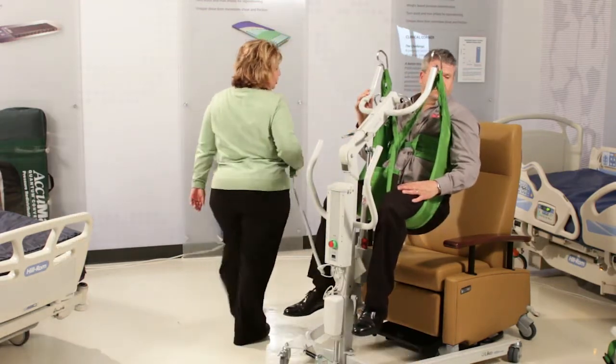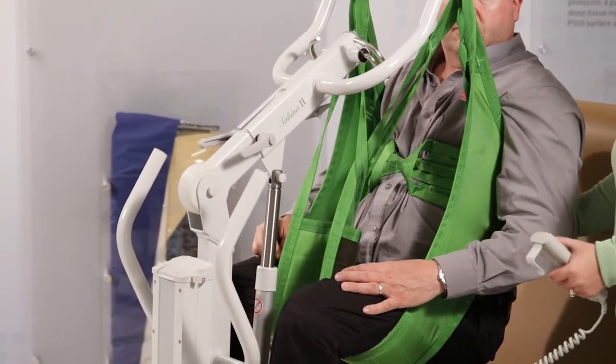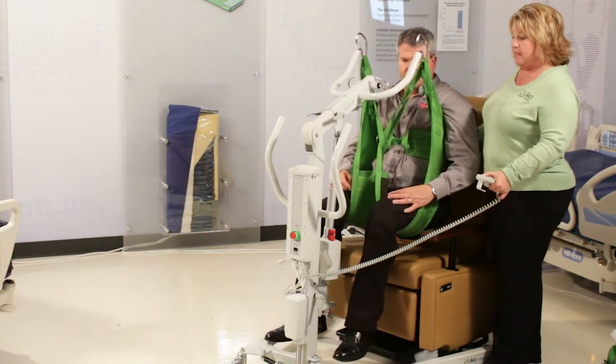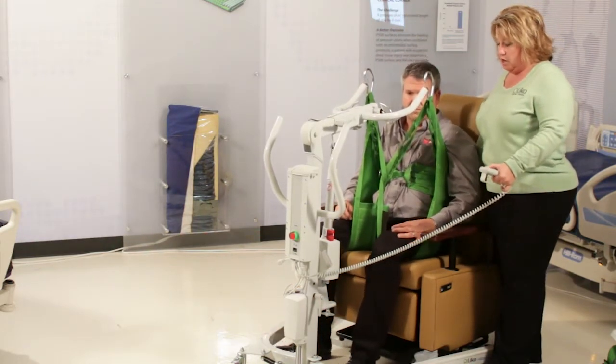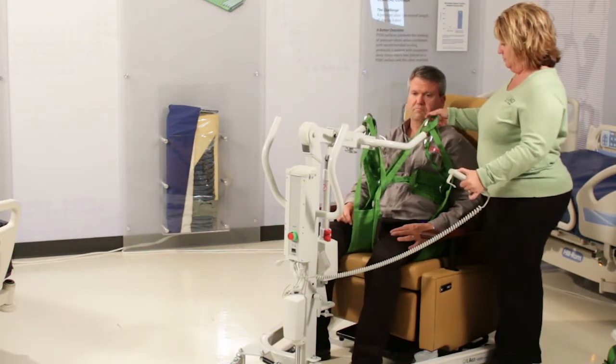Another point: to get someone back into the crevice of the chair, you can pull with the handles and lower at the same time. That way it puts their bottom back into the crevice of the chair. Our slings all have handles on the back of them for that reason.